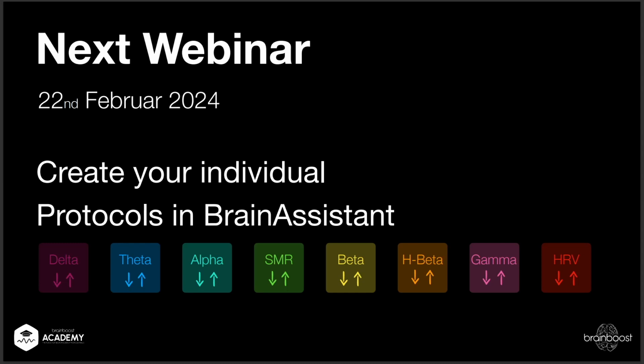So you can make it a little bit more flowing, that's what we call it, the way you can make it comfortable for the person, so that you don't intervene too much and ask, what do you want to play next, and they need to think, etc. Yeah, this is why I say you can be creative. But yeah, thank you for the positive feedback.